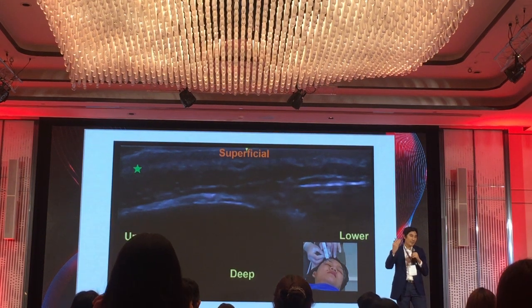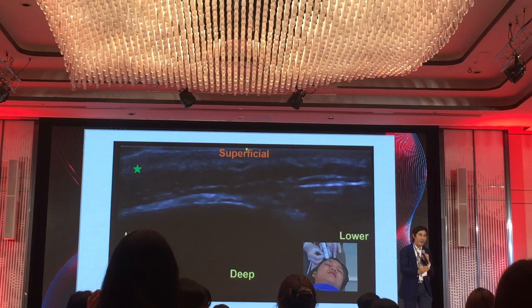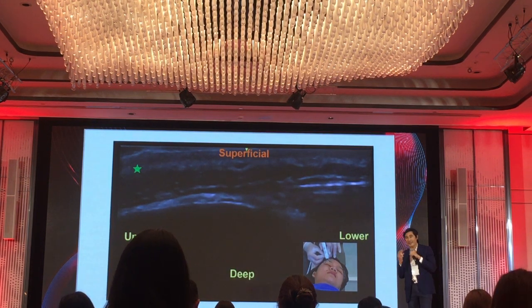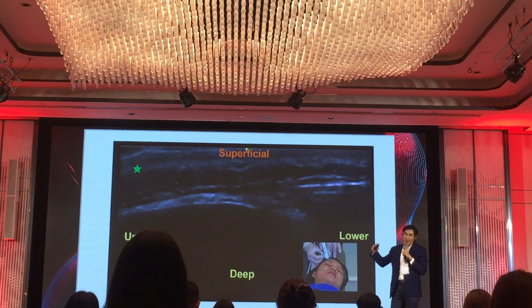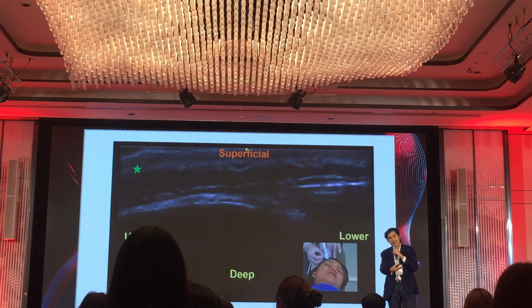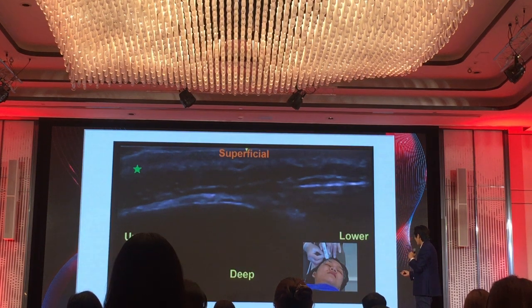And the good thing about ultrasound is that it is live, in real time. The feeling of penetrating the tissue of a patient and the tissue of a cadaver is totally different. So you should do it on your patient and check with ultrasound, not just attend a cadaver workshop and say, oh, you're on the right plane. It's a different feeling, right? You get me right? Okay.